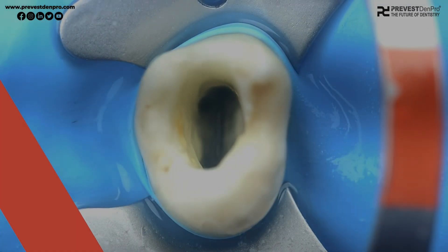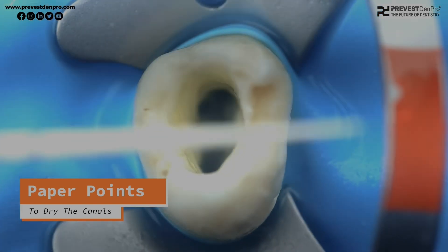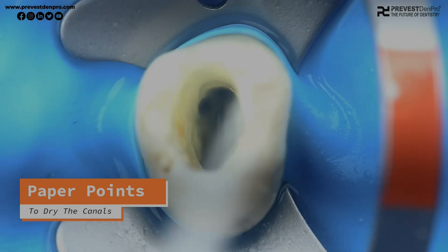Before we begin obturation, we need to dry the canals with paper points, but avoid over-drying, as the sealer needs moisture to completely set and harden.